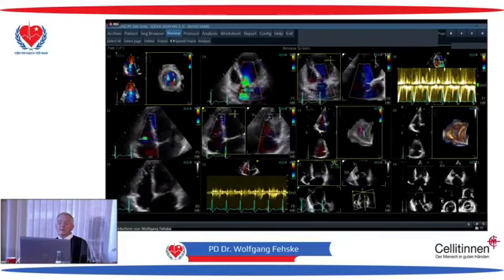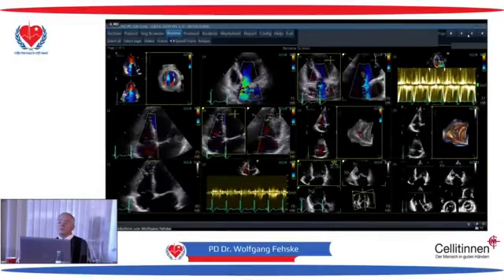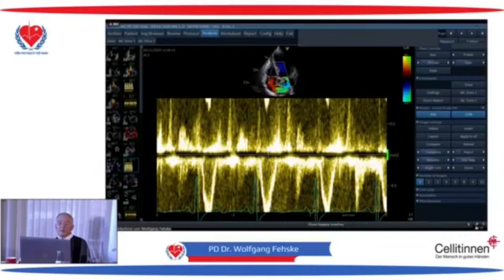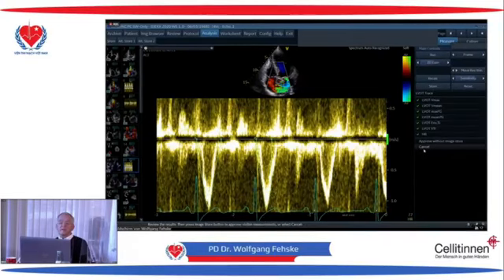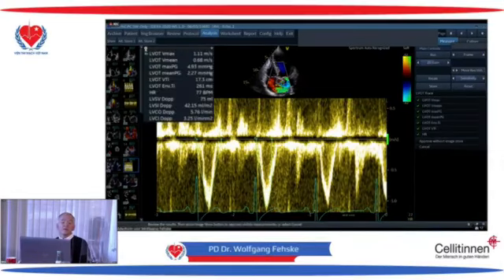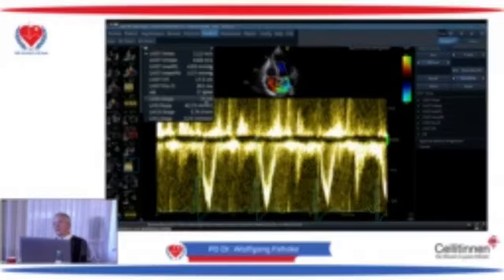And this is what we have to take, and we go to measure, and it does it automatically when I accept it, and this has a stroke volume of 75, which corresponds exactly to the pumping volume of the left ventricle.